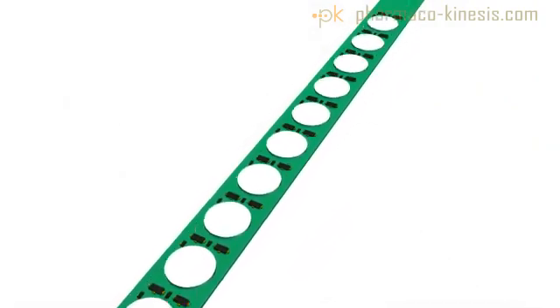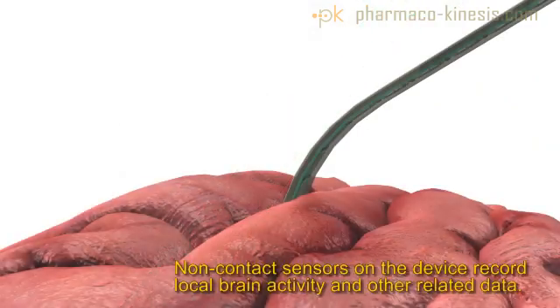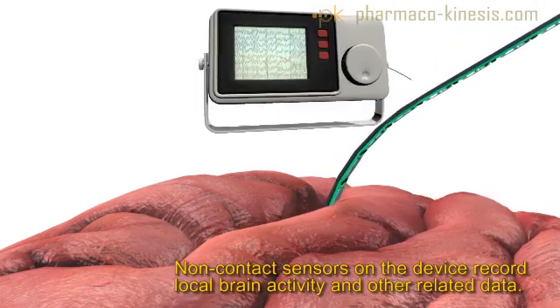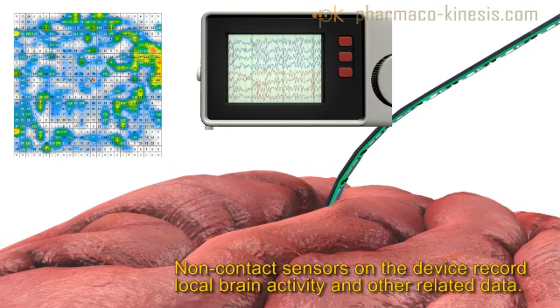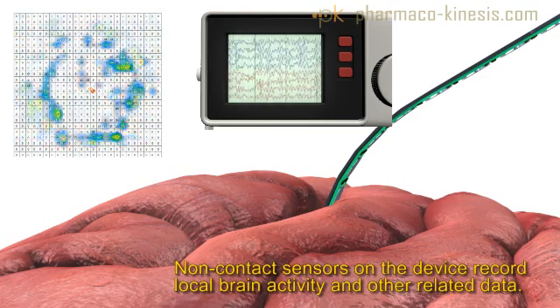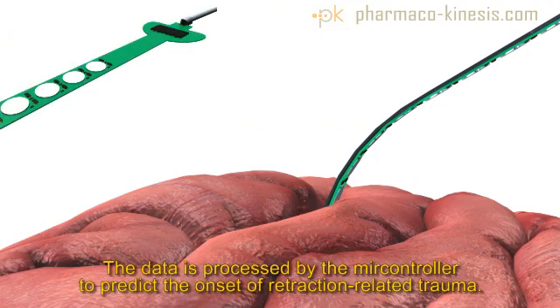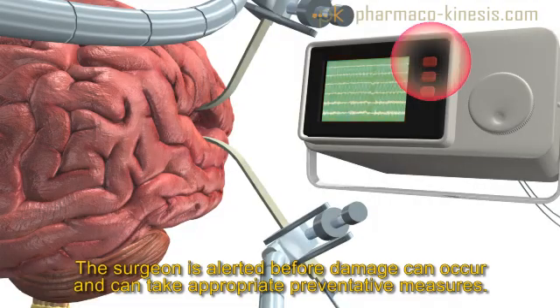Adjacent non-contact sensors on the strip measure the electrostatic field of brain tissue for electroencephalographic indications of local activity, as well as temperature, pressure, impedance, and blood flow. The microcontroller processes the data with a predictive algorithm to identify telltale signs of ischemia and anticipate the onset of damage, alerting the attending staff to a potential injury risk.